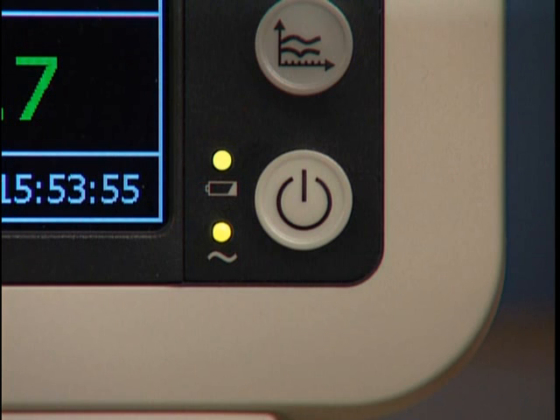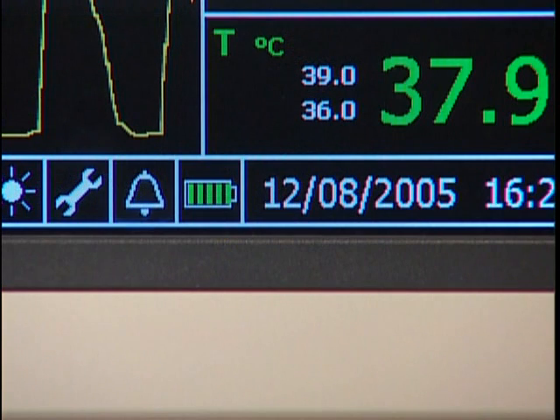Steady green indicates that the battery is fully or almost fully charged. Flashing green indicates a medium charge level, while yellow indicates a need to charge the battery. This icon also indicates battery status, providing a graphical indication of the battery's charge level.